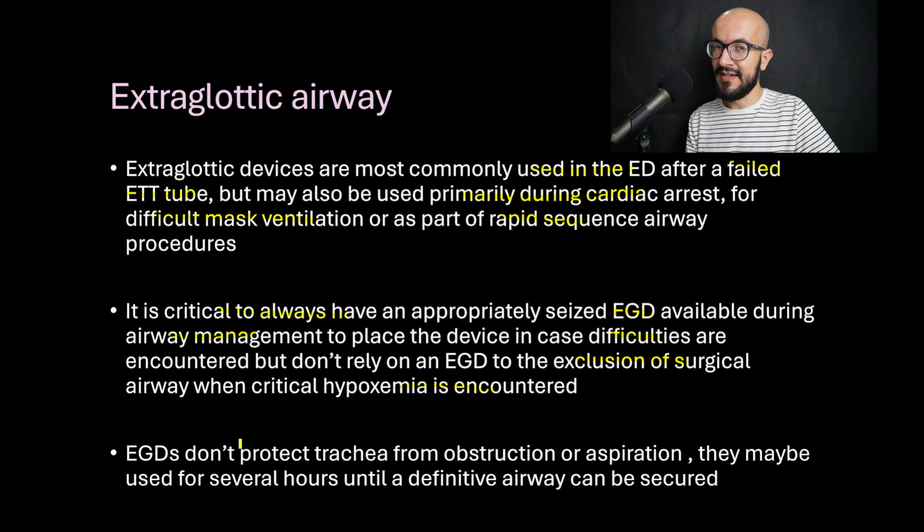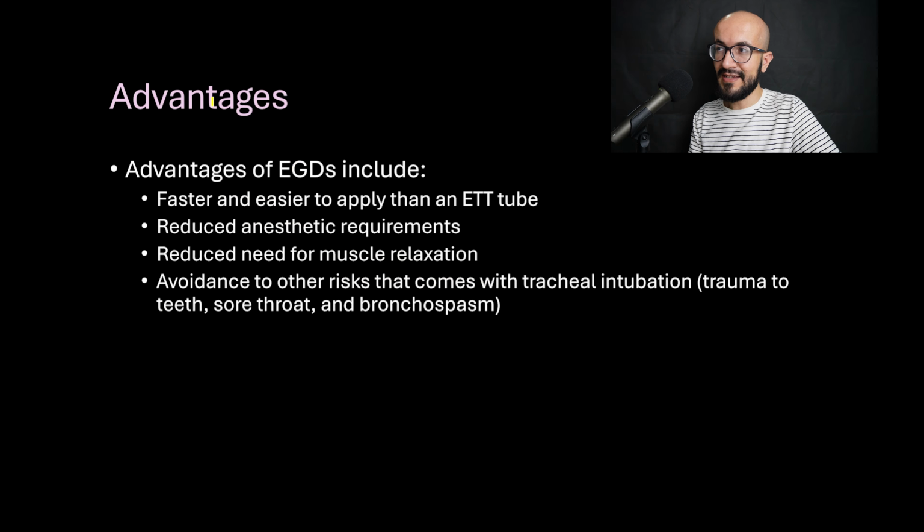And the EGDs don't protect the trachea from obstruction or aspiration, so they are less definitive of an airway than tracheal intubation. And that is why they are used for several hours until a definitive airway using an endotracheal tube can be secured. Now let's talk about the advantages.